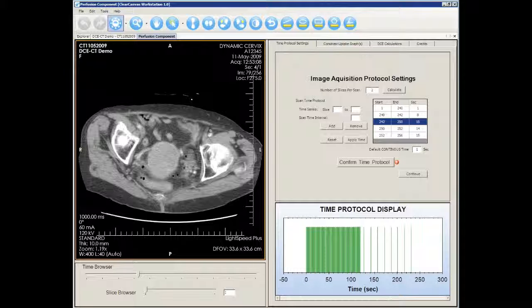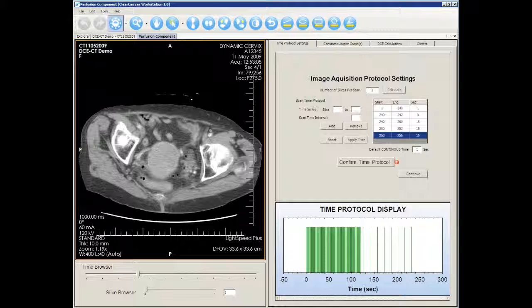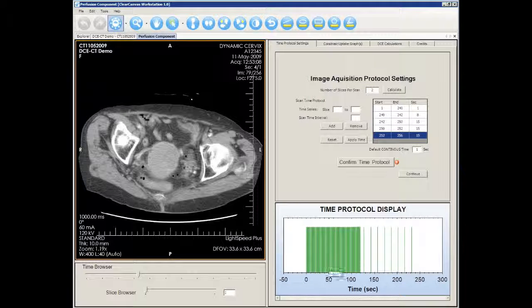Similarly, slices 250 to 252 are acquired at a 15 second interval. Your time protocol is also displayed in a graph here.